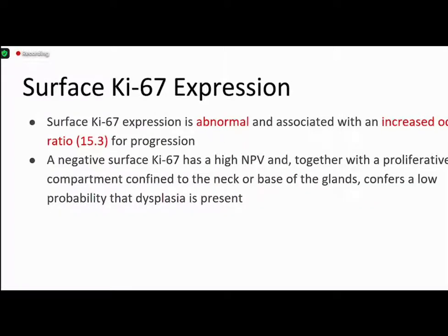For surface Ki67 expression, our study suggests that any surface expression should be considered abnormal, since it's associated with increased odds ratio for progression if there is any surface Ki67 expression in some patients. However, if the surface Ki67 is negative, since it has a high negative predictive value, and that combined with the right histology, meaning that the proliferative compartment is confined to the neck or base of the glands, it confers a low probability that dysplasia is present.